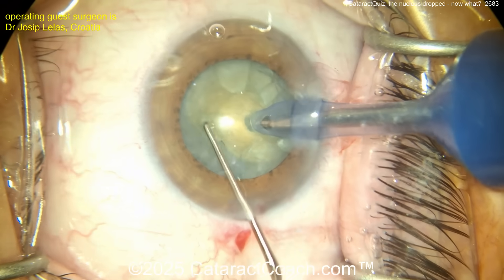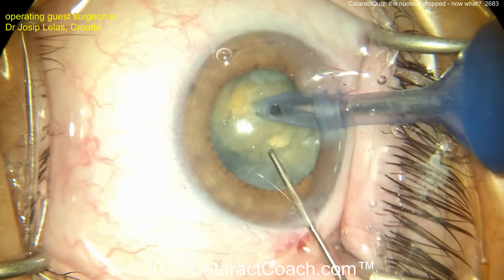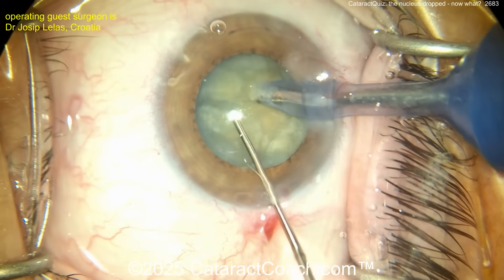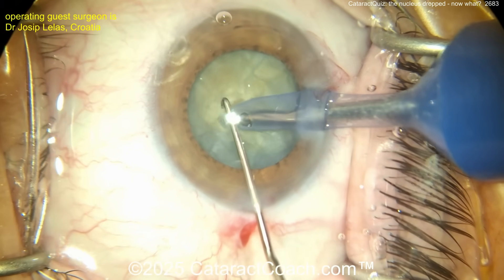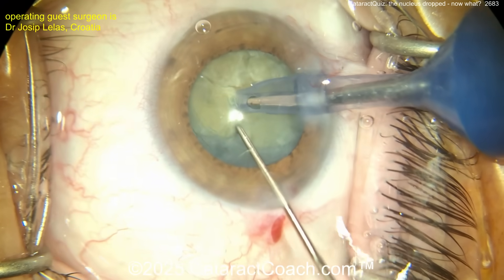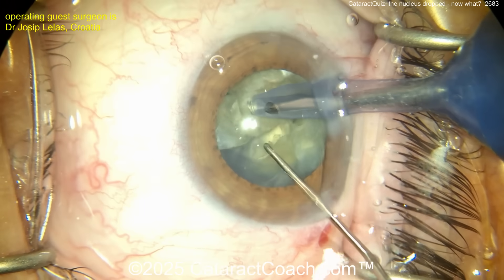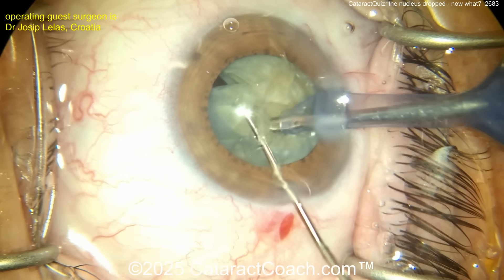There's a groove down the middle — no, actually just a chop. I like that and it looks like it chops okay. But it looks a little deeper now. Is the nucleus being pushed away a little bit? Maybe the bag's already open. Let's find out. Rotating it — so far it looks reasonable. Another chop — fibrous lens doesn't want to propagate too much. Let's see if you can chop it again.